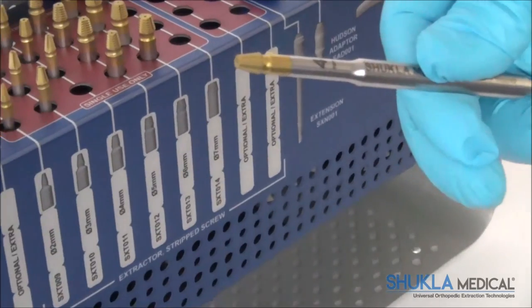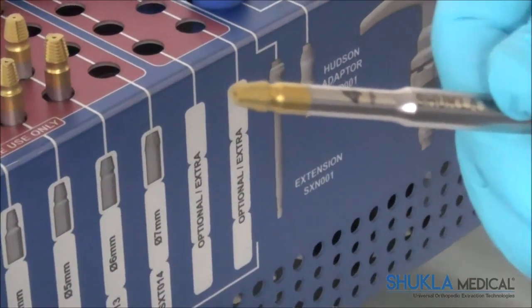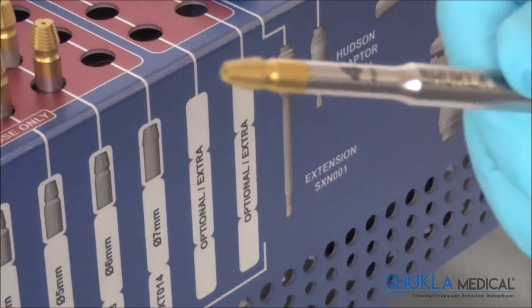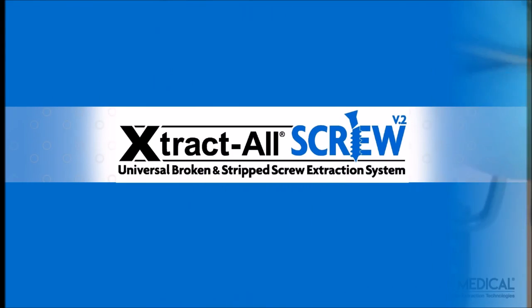These tips are now plated with titanium nitride. This allows the extractor to better engage the well of the stripped screw, so more torque can be applied.